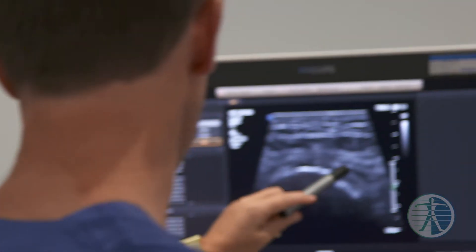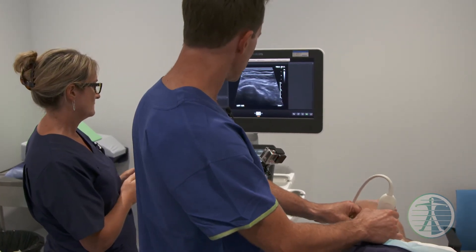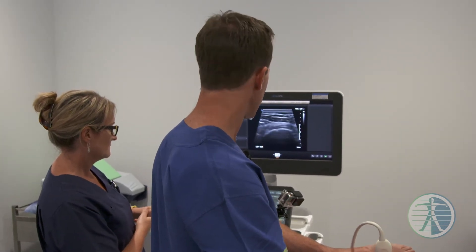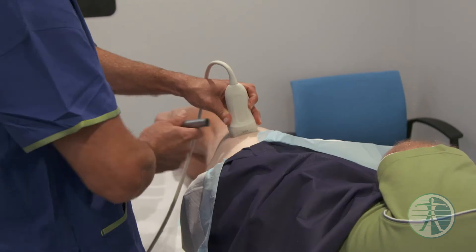Yeah but it'll all communicate won't it? To tell you the truth, the tendon has quite a few areas of irregularity and tearing, so we'll definitely get some of that fluid out of the bursa, but we'll also go to where there's a tear — and that's what I'd like to target with the tear, so that's excellent.